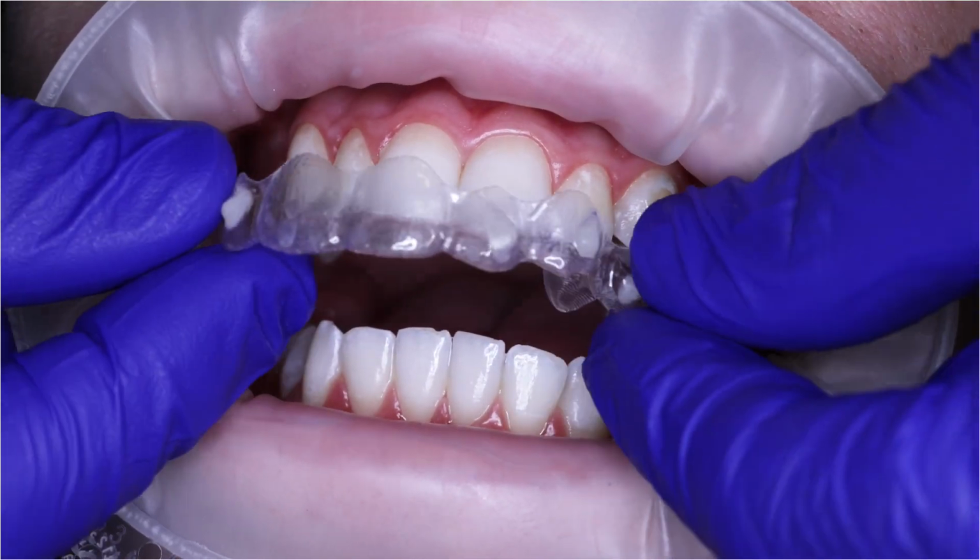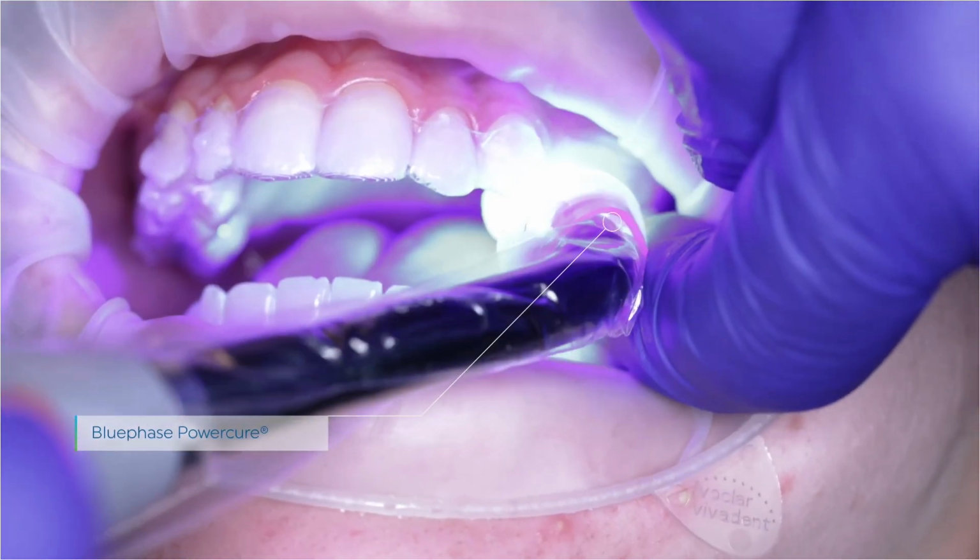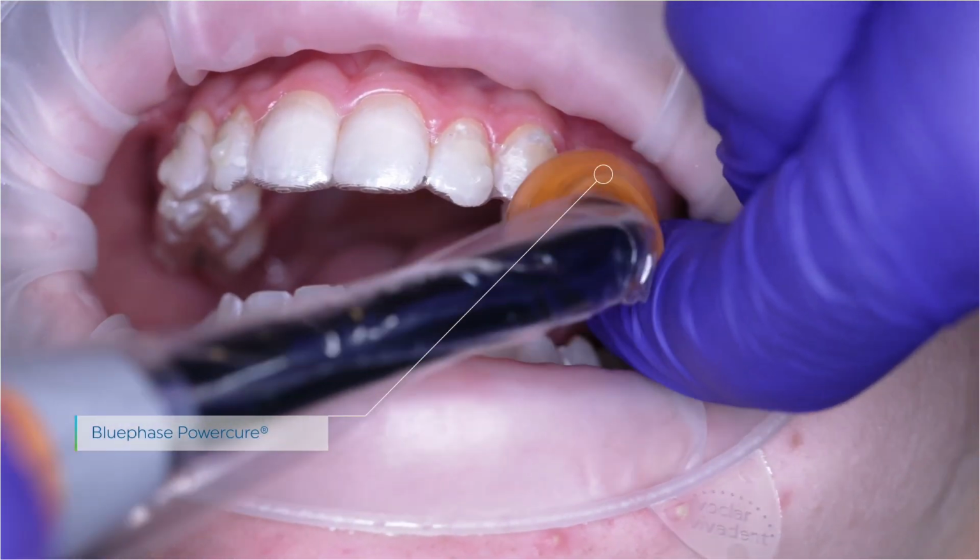Now, I like to preload mine. We'll get into that in just a minute. And as we seat that template, we're going to trace around each attachment with our instrument and cure.